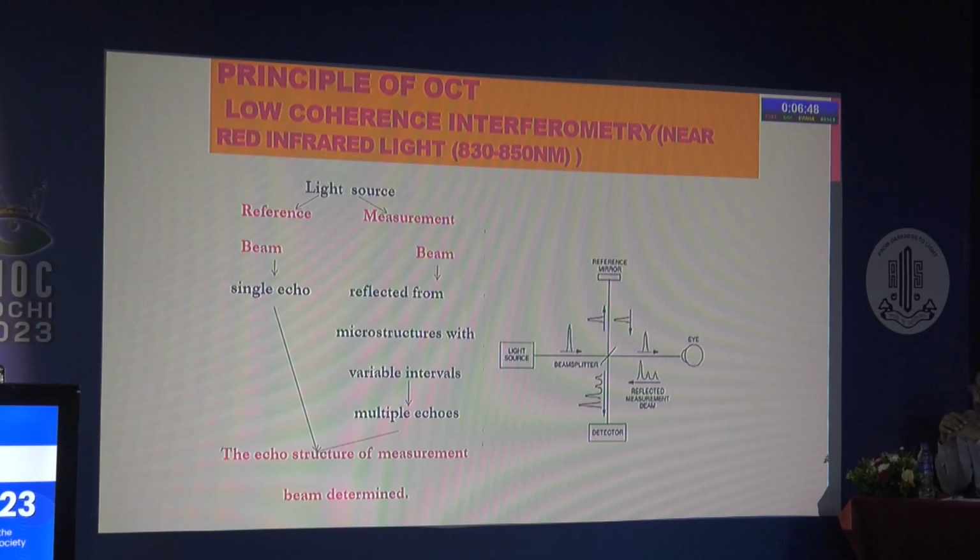Okay, as we already talked about low coherence interferometry, there are two mirrors, one reflects and the other catches, and in between is basically an area of physics that we cannot go deep into. What we are basically concerned with is the type of image that you get. And remember that these images are basically made by the computers, their software, so it can vary from machine to machine.